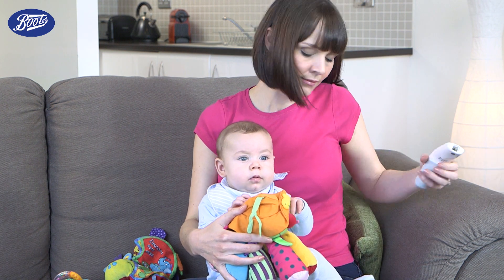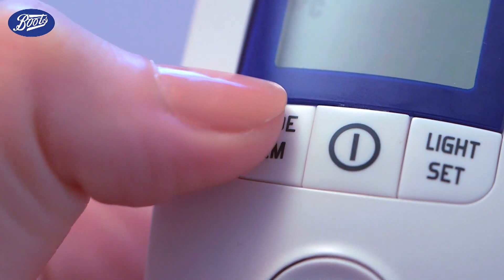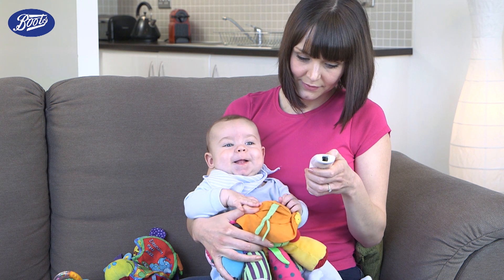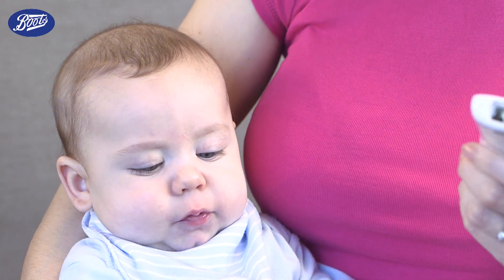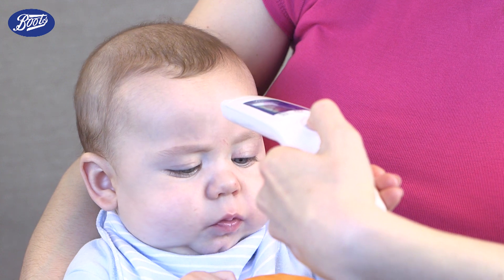To measure body temperature, first switch on the thermometer using the power button. Then ensure that the body mode setting is selected by clicking mode. For best accuracy, check your child's forehead is free from perspiration and any hair is moved aside. Then simply hold the thermometer 2-3cm away from the forehead and press the scan button.